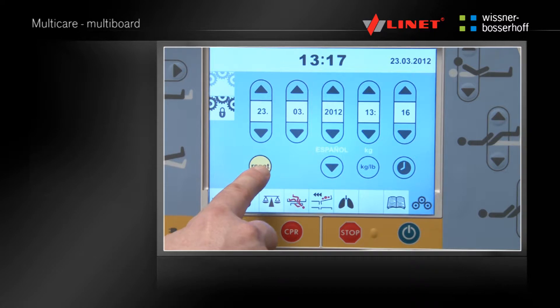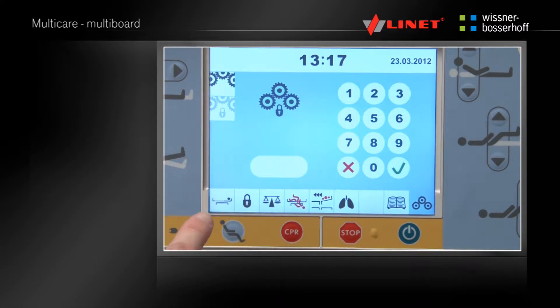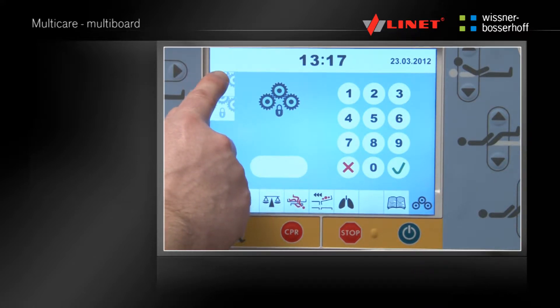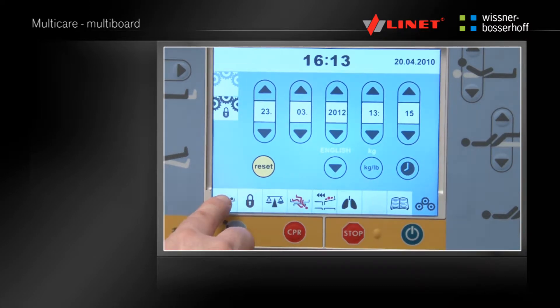By pressing the lock icon in the settings menu, the service menu for the Linet Technicians is displayed. After switching to any other menu, the settings will be saved.